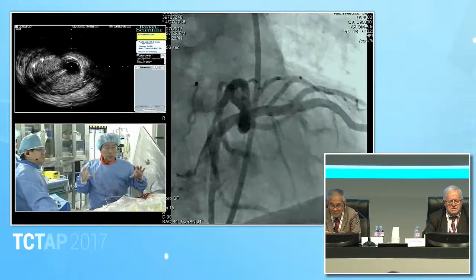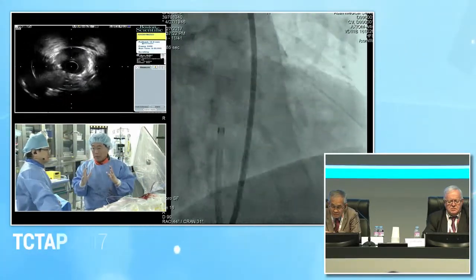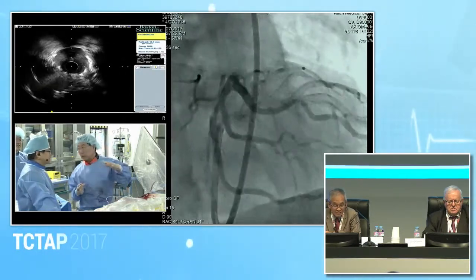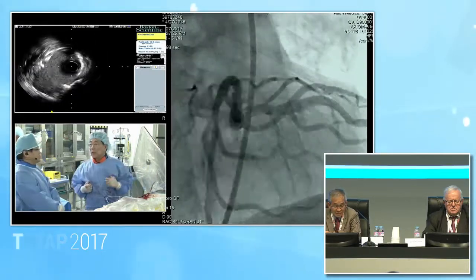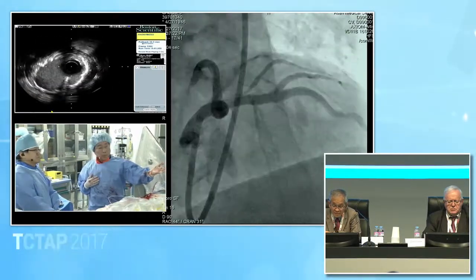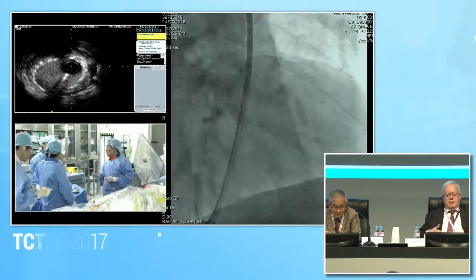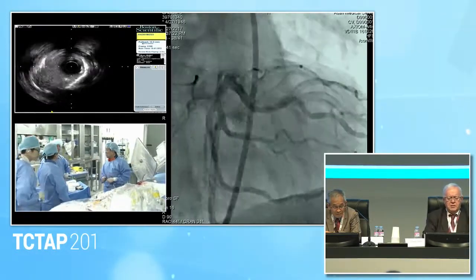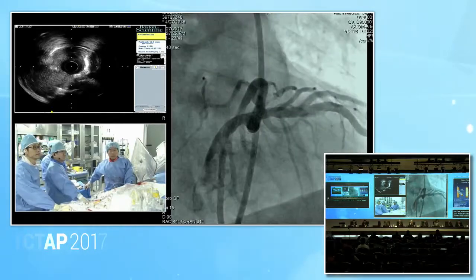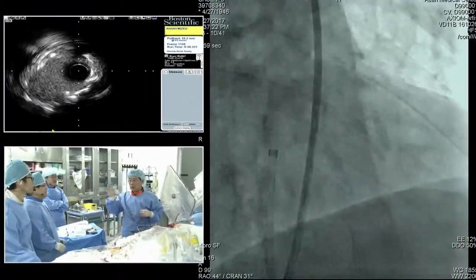If we want to do this kind of two stent technique from the beginning, IVUS guided, we're going to choose a little bit bigger stent size, the 2.75, 3.5, up to high pressure dilations. That can make a big stent area. The reason why, current status, right? You got some lots of data over there. Current status, bifurcation strategy cannot differentiate between a single stent and just a two stent technique.